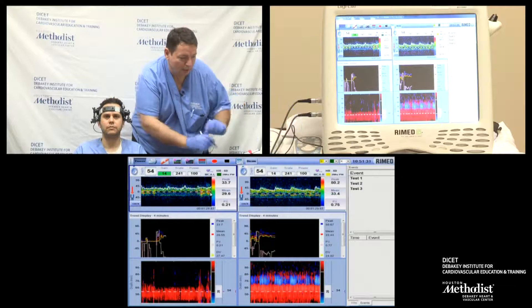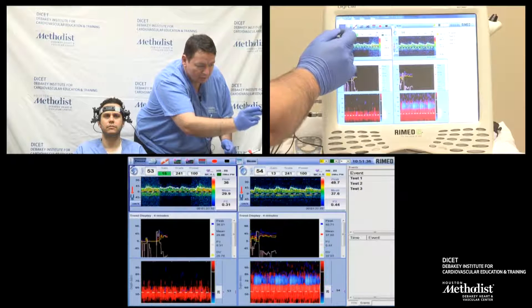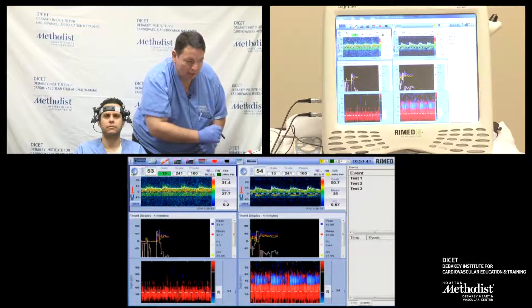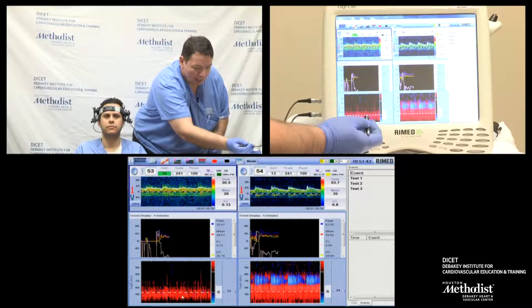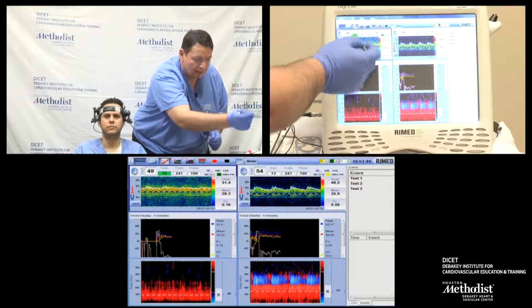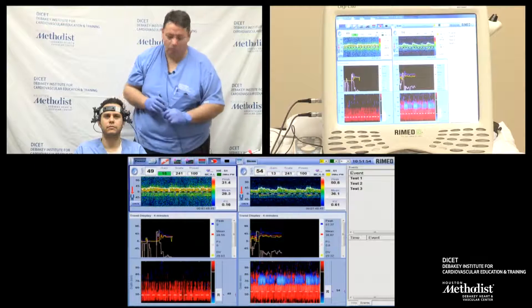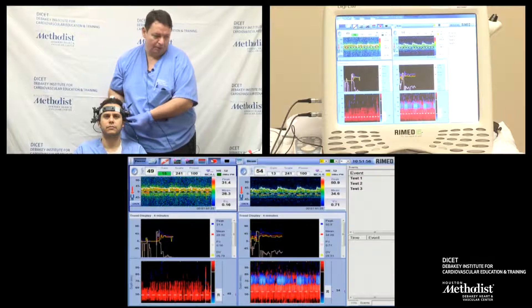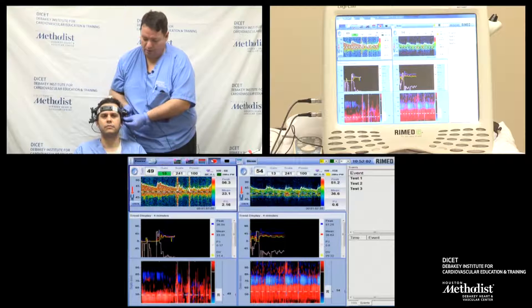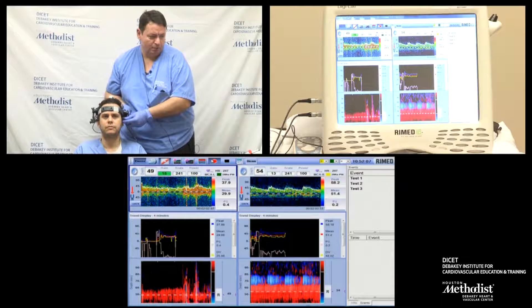Right now I can increase my gain — if it's not perfect, I can increase my sound. I'm now ready for monitoring. I'm going to turn on my emboli detection and start my recording. If I'm not happy with the signal, especially on the left side, I can still adjust it. I really need to see that positivity in the middle cerebral artery.